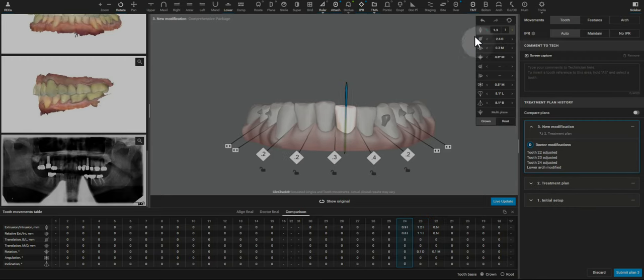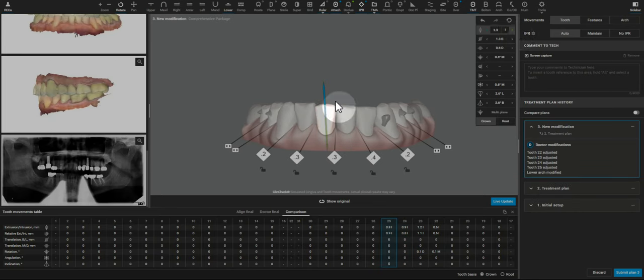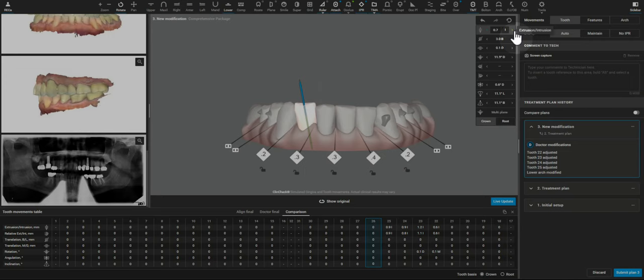Yes, this is going to increase the number of aligners, but it's also going to improve the overall outcome.